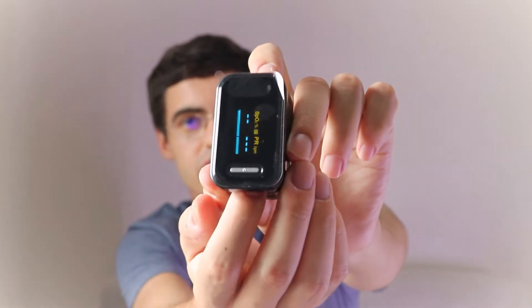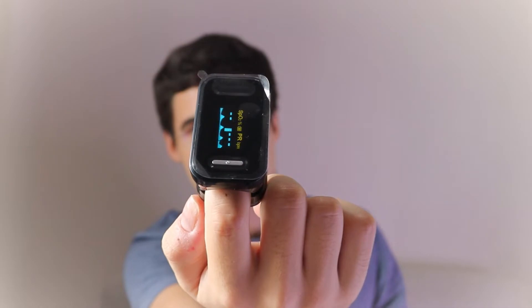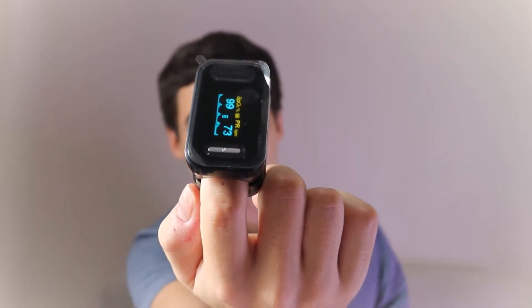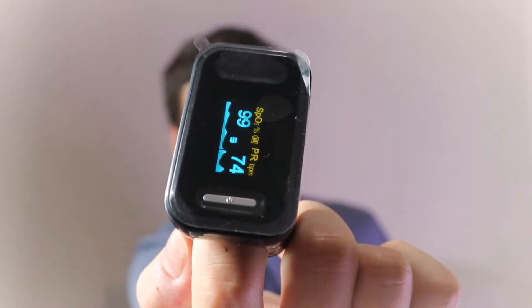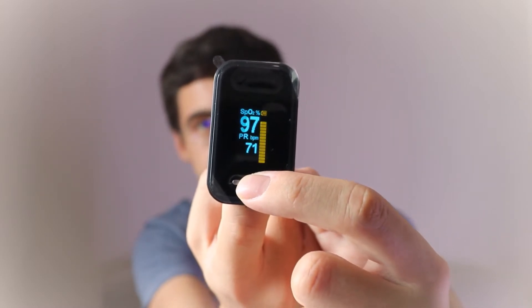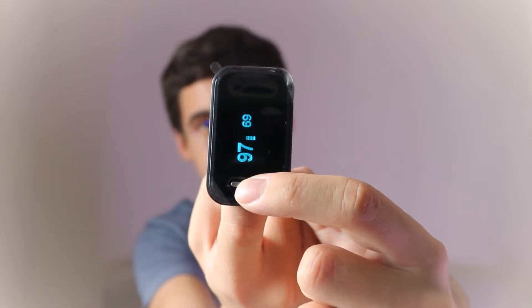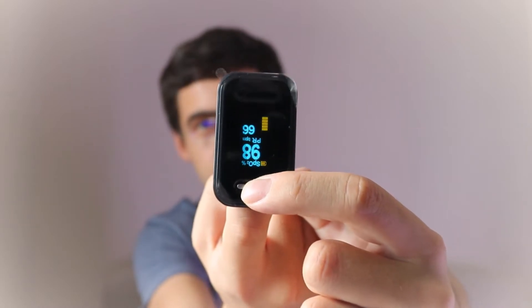This fingertip pulse oximeter only has one button. Underneath the screen there's a silver button for power on. You can take the plastic off the screen that comes on the oximeter. When you press the button it switches on, then you put your finger inside and it checks the pulse, giving you the oxygen saturation number and the pulse. Clicking the button changes the display mode of the data — the pulse and blood oxygen saturation level.